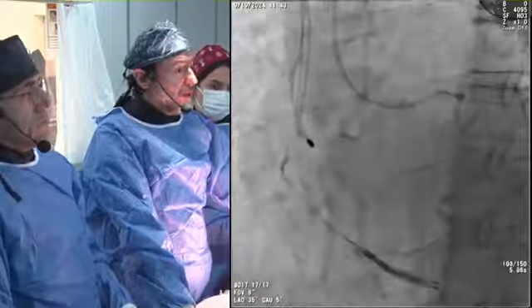You have done a fantastic job so far, and as you described, if you keep the knuckle wire just in front of the proximal RCA cap, then you can narrow down the antegrade puncture point. That is the only way to focus on the antegrade direction. Both LAO and RAO cranial projections for confirmation are necessary. Okay, thank you very much.